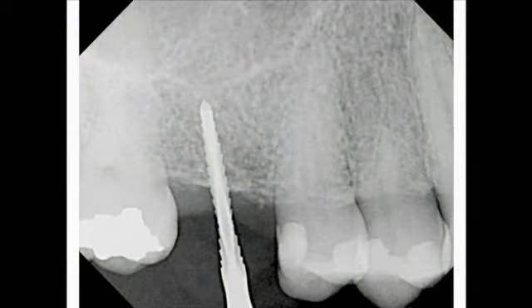A digital radiograph is taken to determine the angulation of this primary first drill. If we needed to move the position, we could simply do that because we didn't really penetrate the bone very far. We could move it mesially, distally, or work on the angulation as we wanted to.